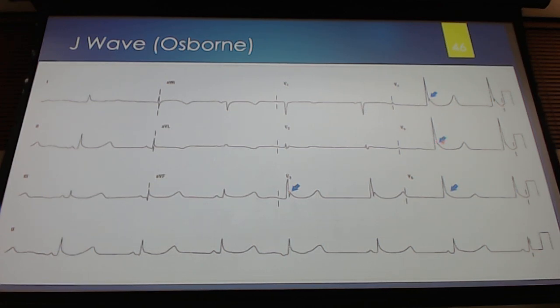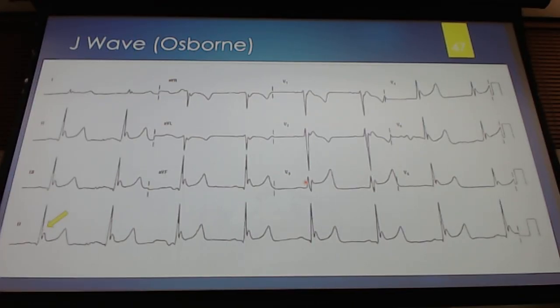You don't really see it here. I mean, I can see it because it kind of pokes in, and then not really much here, but that's a J wave. And then here, would you agree that you can maybe see it a little bit more prominently on this EKG? We've got a J wave right here. So we've got our P, we've got our Q, R. We don't really come back down to baseline, so we've got an elevated J point, but also on top of that, we've got this thing that kind of strap hangs on the back of that QRS complex.